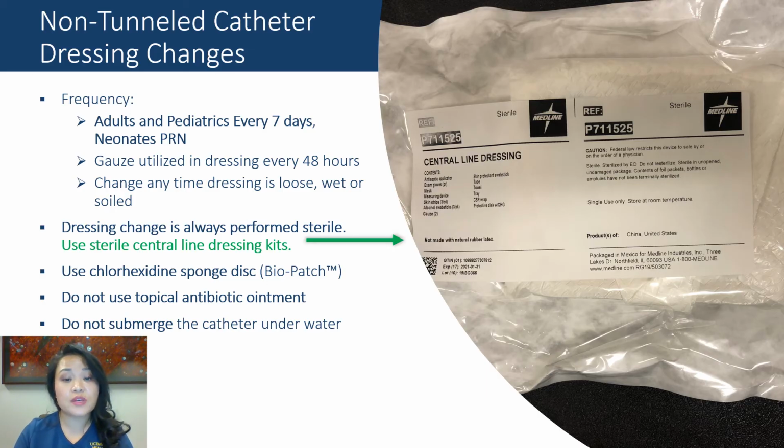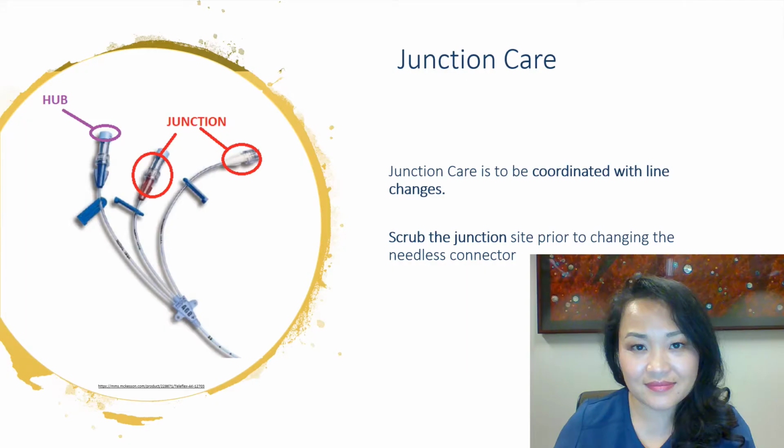Dressing changes should be completed every 7 days for adults and pediatrics. Just like you scrub the hub, you will need to provide junction care prior to accessing IV injection ports and prior to tubing or needleless connector changes.